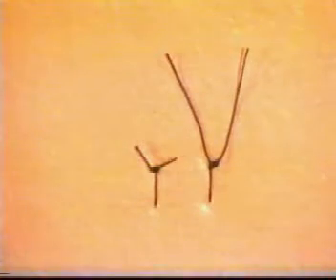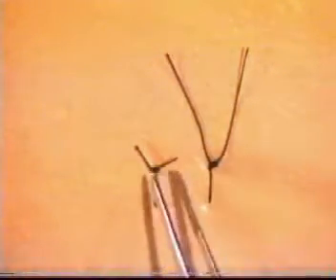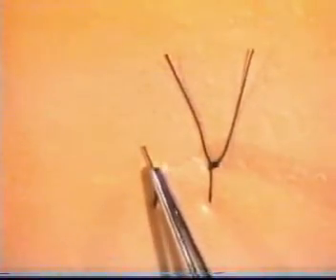However, don't cut them too short, otherwise this will be insecure, and might even lead to the unravelling of the knot. Cut the suture to such a length that it will be secure, and also allow the suture to be grasped.